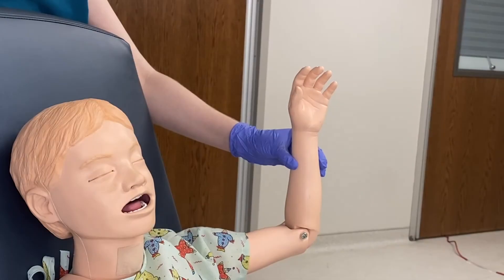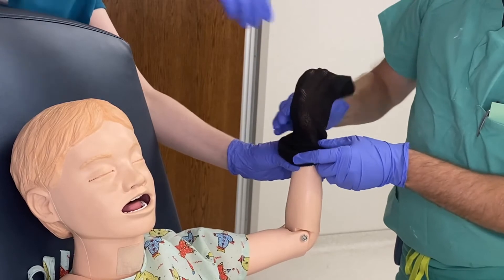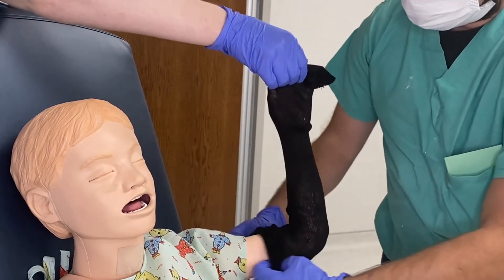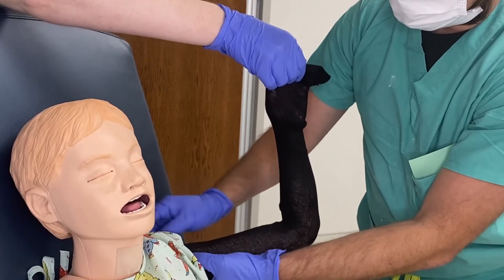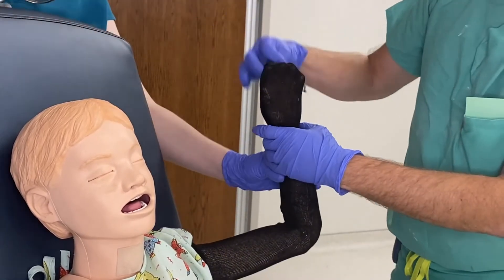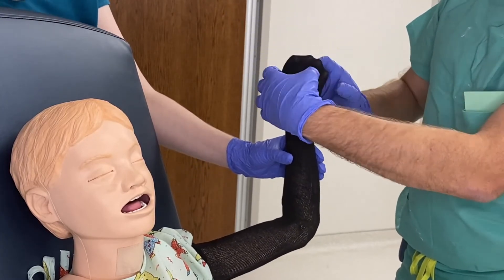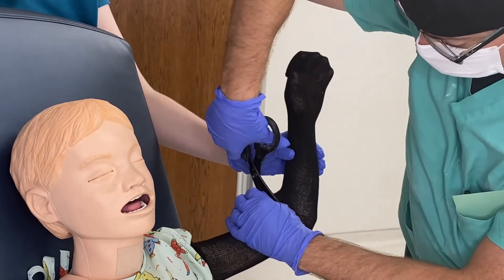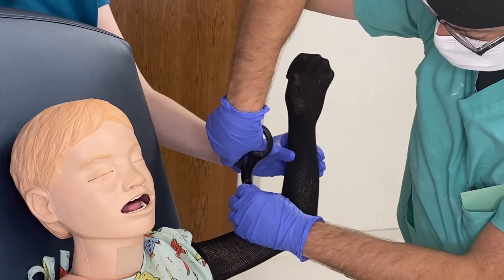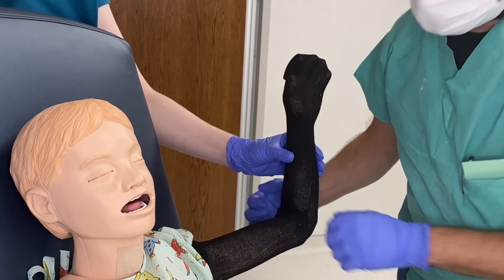This is the long arm mitten cast demonstration. To start, take your stockinette and go over the fingers. Instead of leaving the fingers frayed inside the cast, take the excess stockinette and just fold it over. Remember to cut right here so the stockinette is lying flat and not crinkled or bunched up.